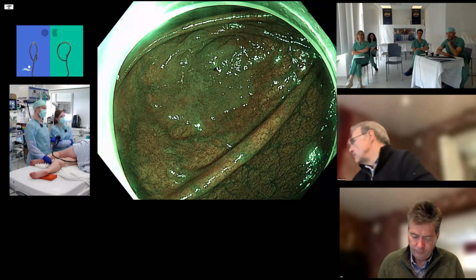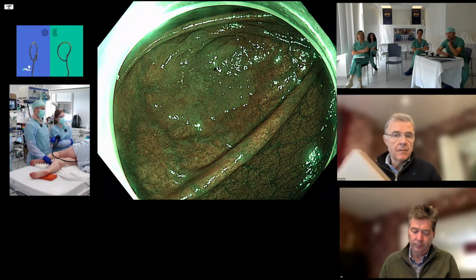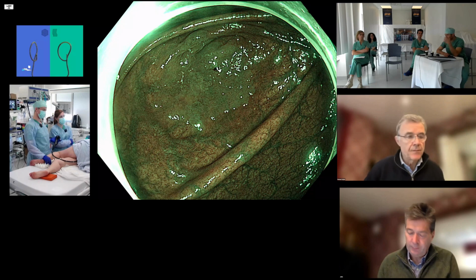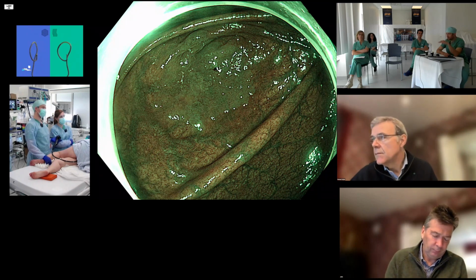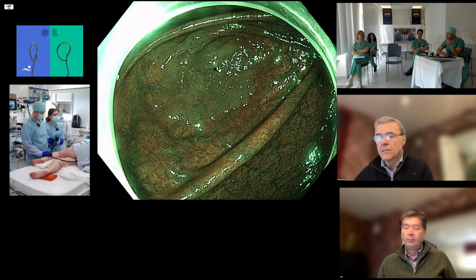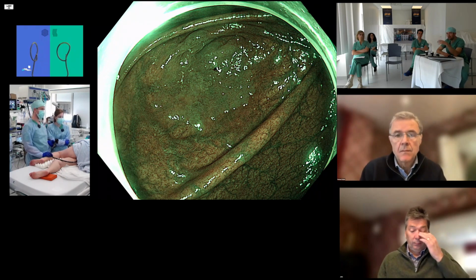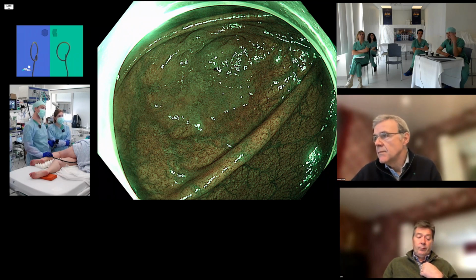Right. So for us, and we'll go into blink impression later, it is something that develops as you see lots of polyps. You just have that feeling, is it cancer or not? And we're not talking about, is it serrated? Is it tubular adenoma? Is it hybrid? We're just saying, is it cancer? And we'll explain how we think that's made up. But my blink impression here for cancer is that it definitely isn't. And probably you will have the same response.